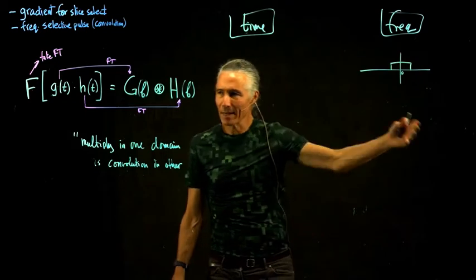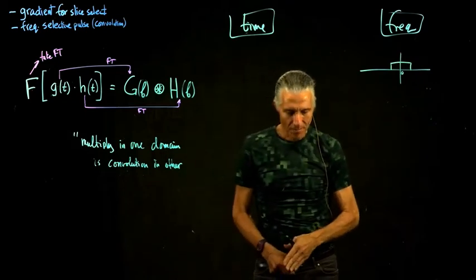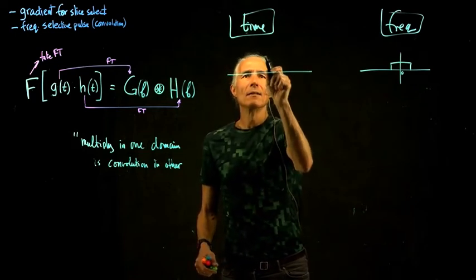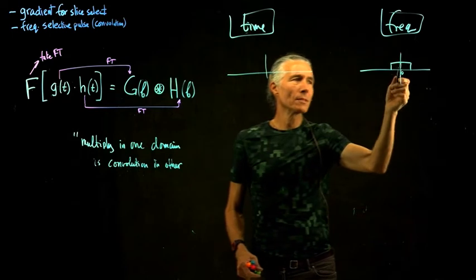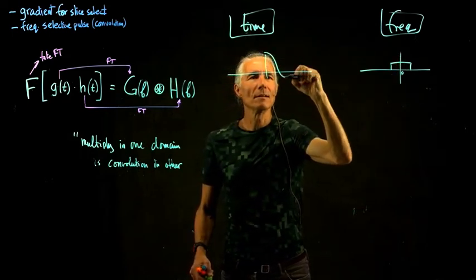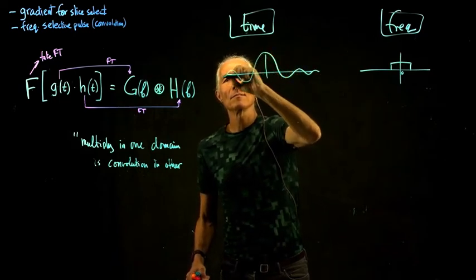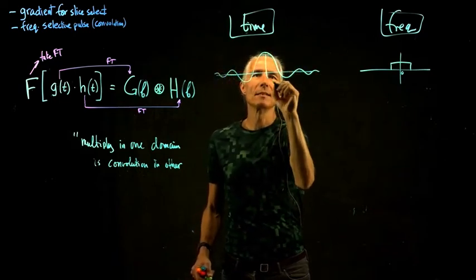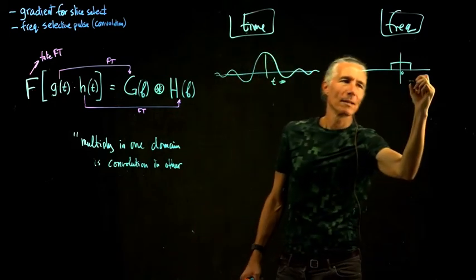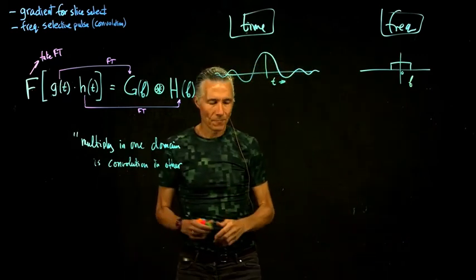We don't want that. We want it displaced. But how do we get it displaced? That's the goal. And so we know that this guy Fourier transforms into a sinc function. So here's our sinc function. That's something we already knew. So this was time going this way. If you have a signal in time like that, that corresponds to a band of frequencies centered around 0.